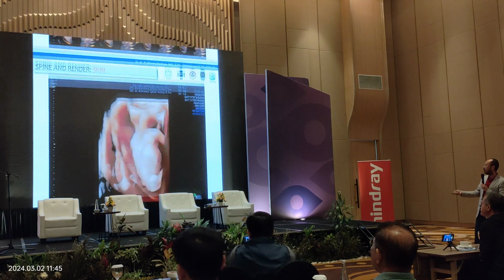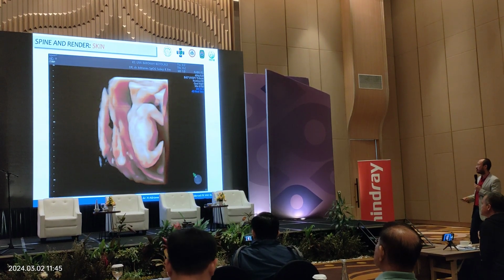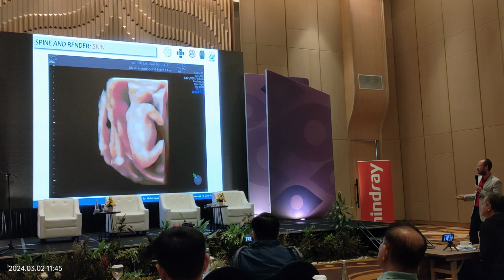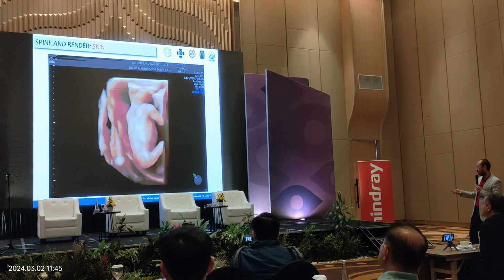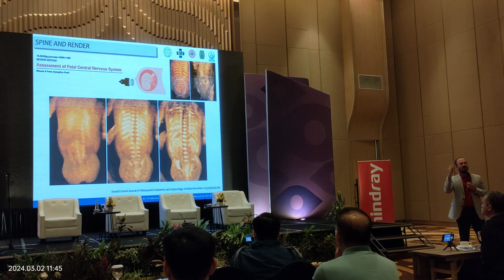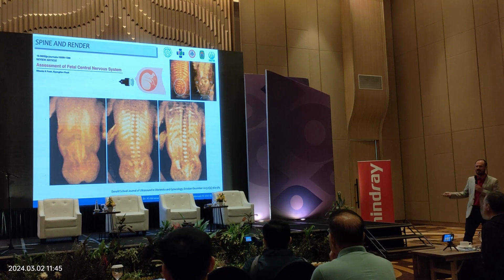Yeah, this is a tomography. I will make it fast. Here we can see the skin is very good, very smooth. There is no hole. But by using the tomography, OmniView or CMPR, we can see if there is a problem like this. Seeing an open spina bifida by only seeing the skin is sometimes very hard if we are not seeing the bone, the vertebrae.